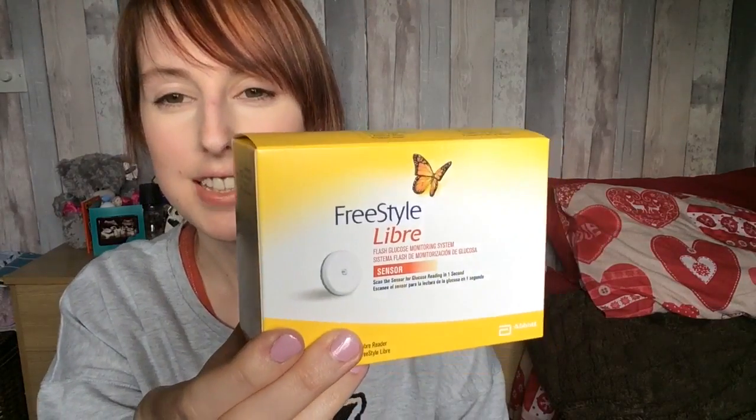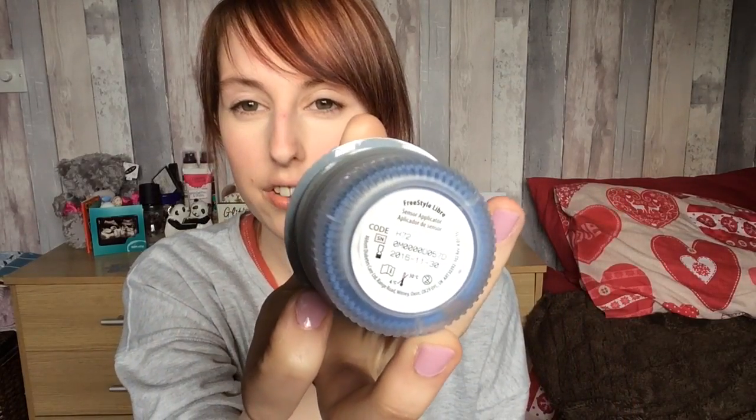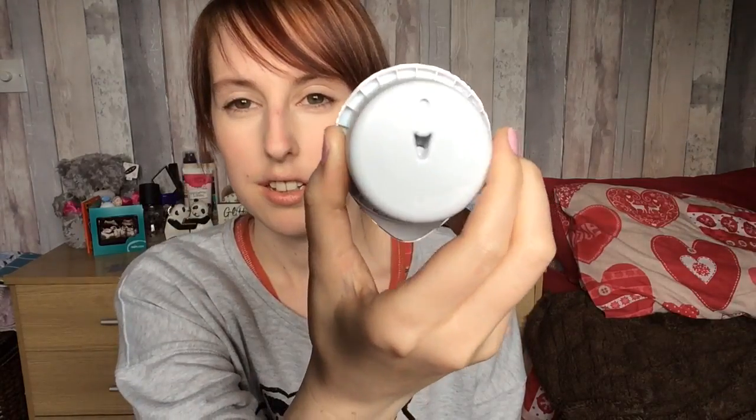So here is the box for the sensor. It says scan the sensor for a glucose reading in one second — I'm very excited about that. It says it comes with the sensor applicator, sensor pack, alcohol wipe, and product insert. So yes, we do have the sensor applicator, the sensor pack, and also the alcohol wipe to use before you place your sensor.